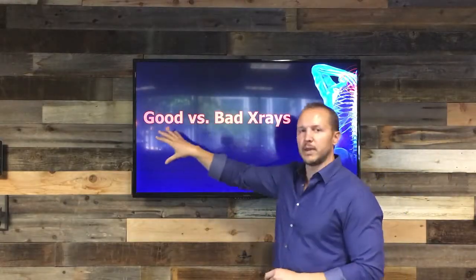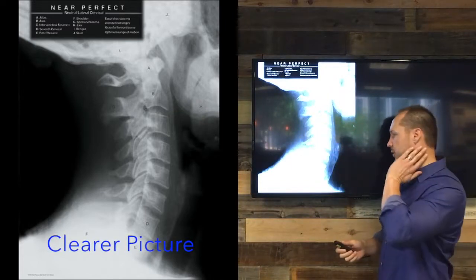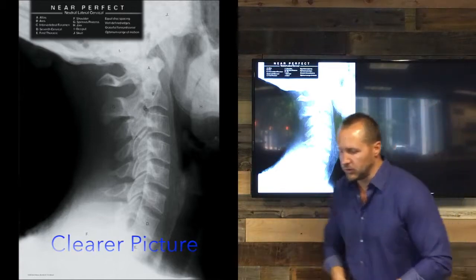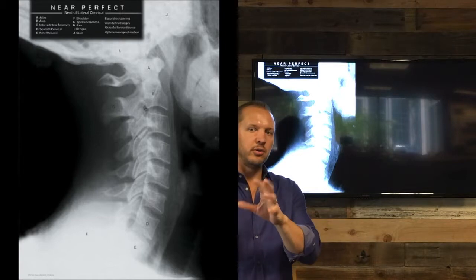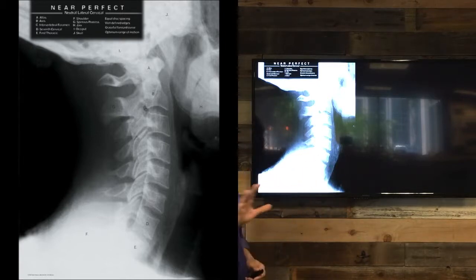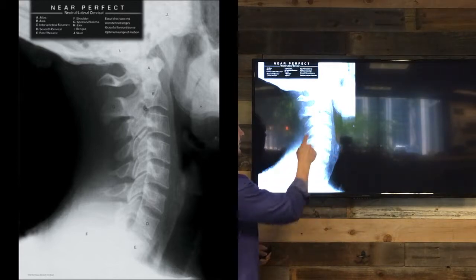So let's go over what good and bad x-rays look like. So this is a side view x-ray. So we're looking at the side of a neck. We took this x-ray of you, and this person would be facing this way. So we're going to show you this x-ray of yourself once you come back in. So I want you to notice a few things. Again, this person is looking this way. We're looking at the neck from the side.